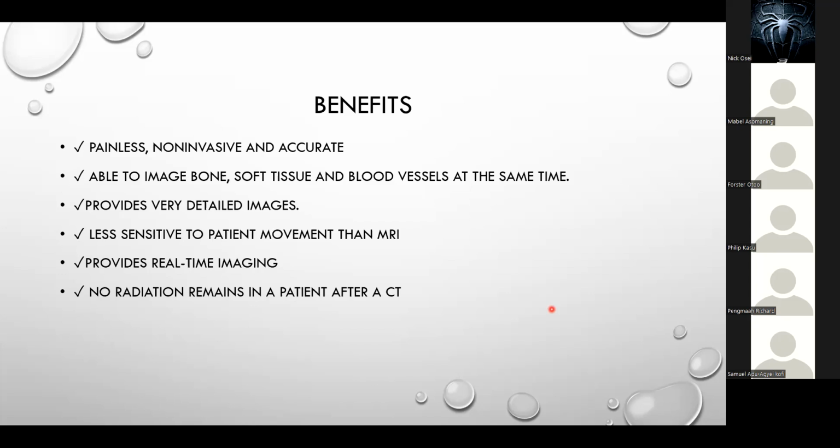Unlike MRI, where the patient has to be completely still, this one is not as sensitive to movement. And then it provides real-time images. That is how we're able to use it for biopsy. And also, there's no radiation remaining in the patient after CT.